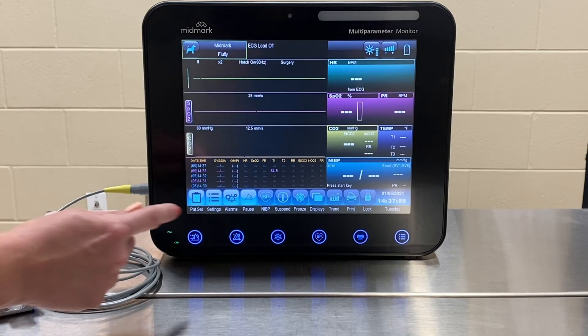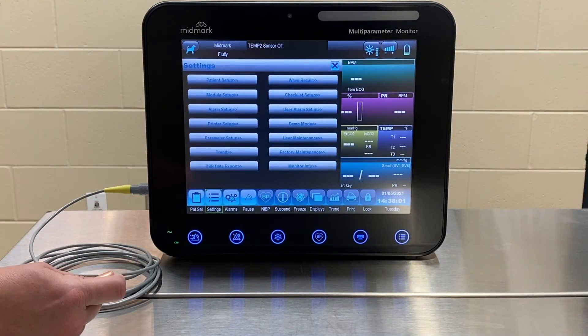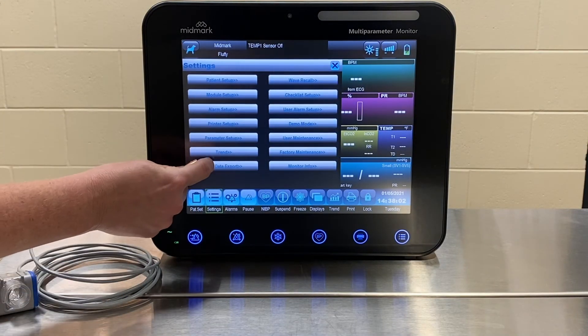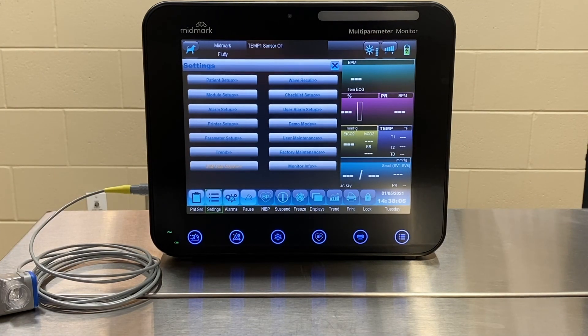Once the procedure is complete, press Settings and select USB data export. When complete, the screen will display file export success.